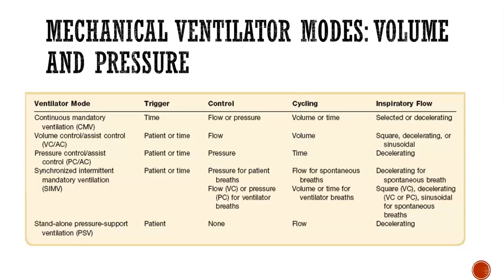Okay, then we have the SIMV, which is the most common. Honestly, I've seen SIMV and AC, really the two big ones that are used. Control does not appear in the title. Patients take control over their breathing. So breaths and ventilation are delivered when the patient initiates that spontaneous breath. The vent just supports the breath, using the same settings as discussed before. This just lets the patient drive the volume and the length and depth of the breath.